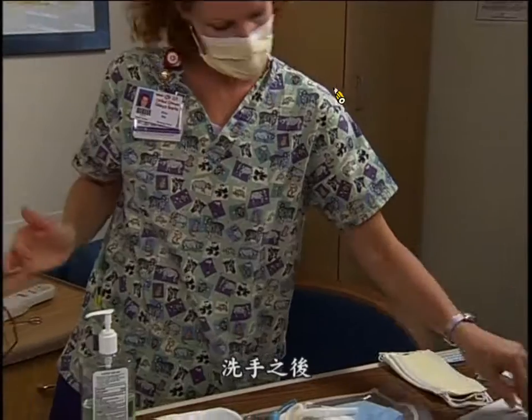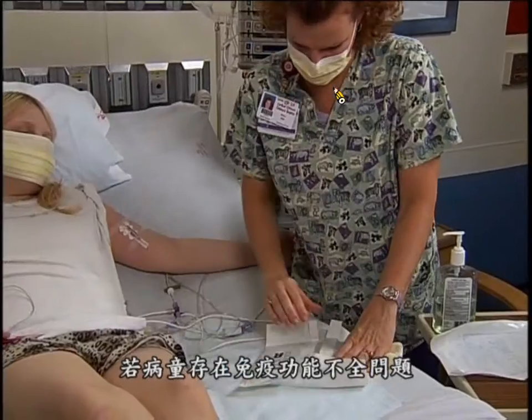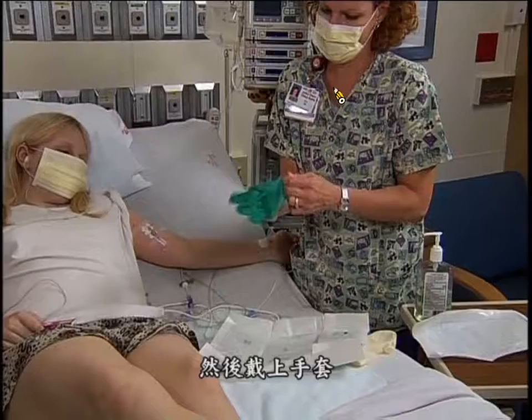After washing your hands, open the wrapped sterile dressing change kit. If the child is immunocompromised, put on a mask and have the child put one on too. Then put on gloves.